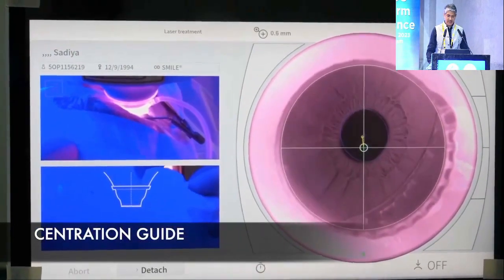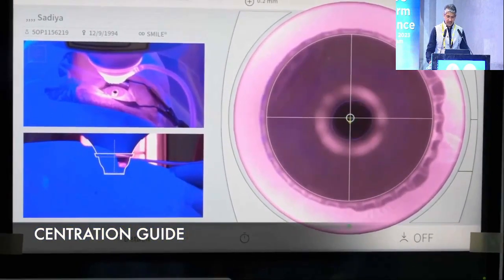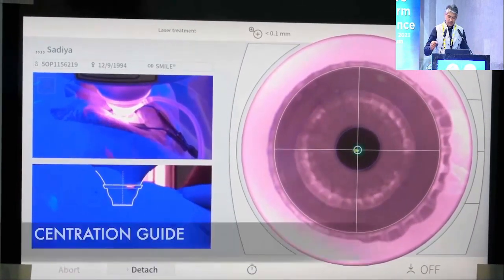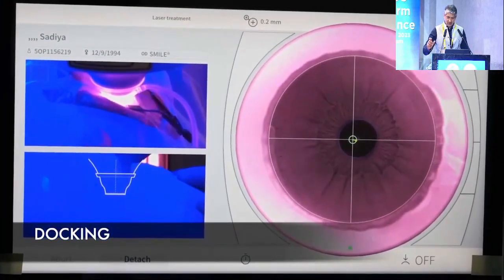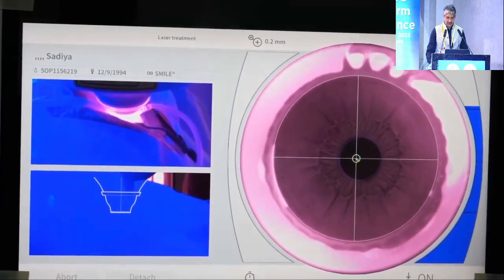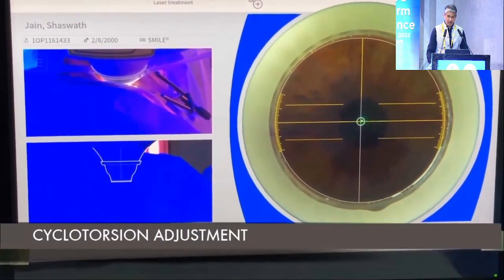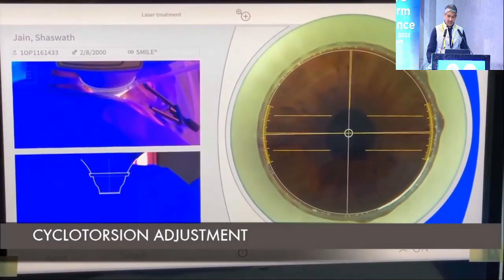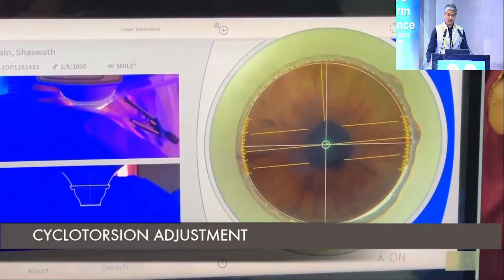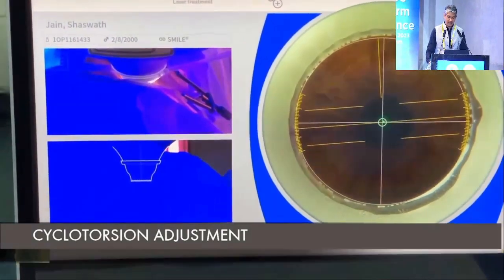And then this is the infrared to have the centration guide. So this Visumax 800 has a centration guide where you can center on the visual axis, and that is how it's different from the 500. You can see that it shows you if you're away from the visual axis, that's a cord which you have to shorten, and then you can dock on the visual axis. It also has cyclotorsion adjustment, but you have to mark the 180 degrees, and then by rotating the joystick, you can actually rotate the axis of placement of the treatment, and so you can compensate for static cyclotorsion.